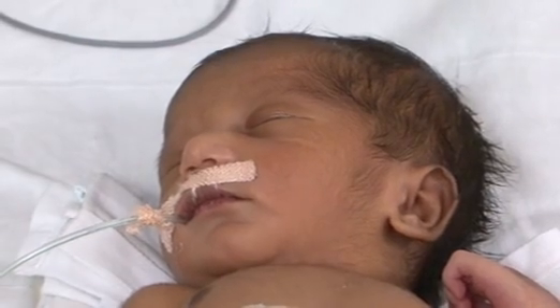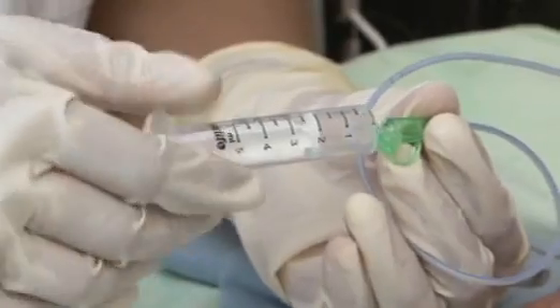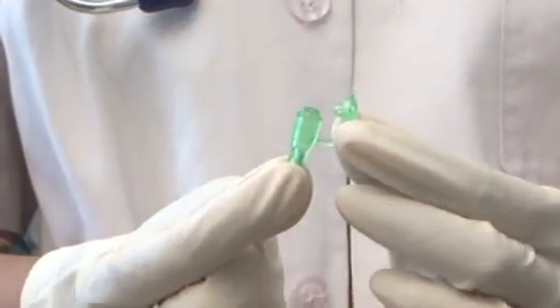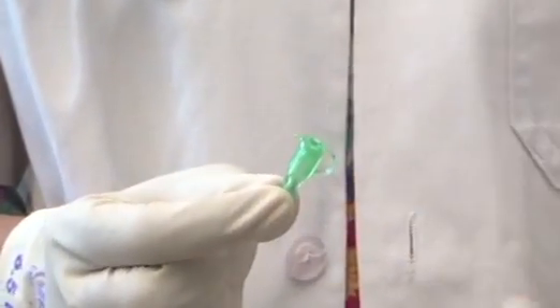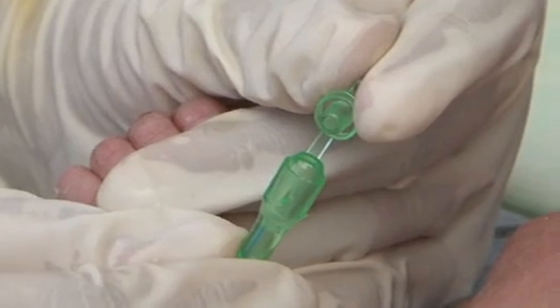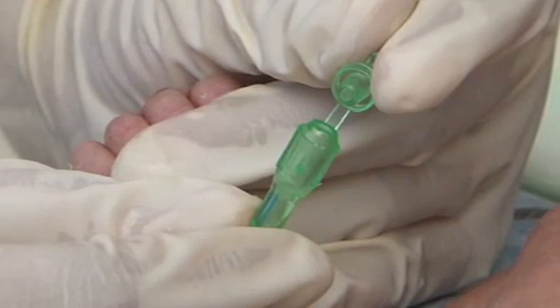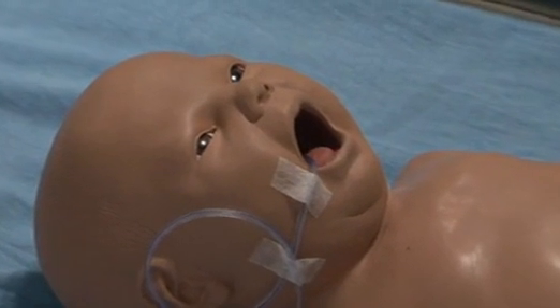Keep a close watch on the newborn for breathing difficulty and color changes. Remove the syringe and close the orogastric tube hub with a stopper. If the orogastric tube is for distension of the abdomen, leave the stopper open. Secure the tube by making a loop and gently stick it on the cheek.